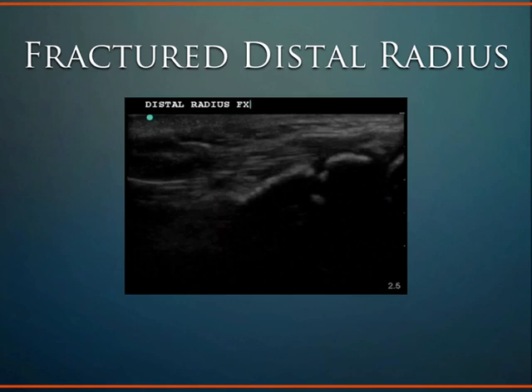surface of the skin, and there typically tends to be a lot of fluid collection and hematomas in association with fractures. And as we know, water and fluid helps the penetration of the sound waves, and so the hematoma actually helps a little with visualization of the actual fracture. So you don't have to push that hard. You do find that maximal point of tenderness and then visualize there.